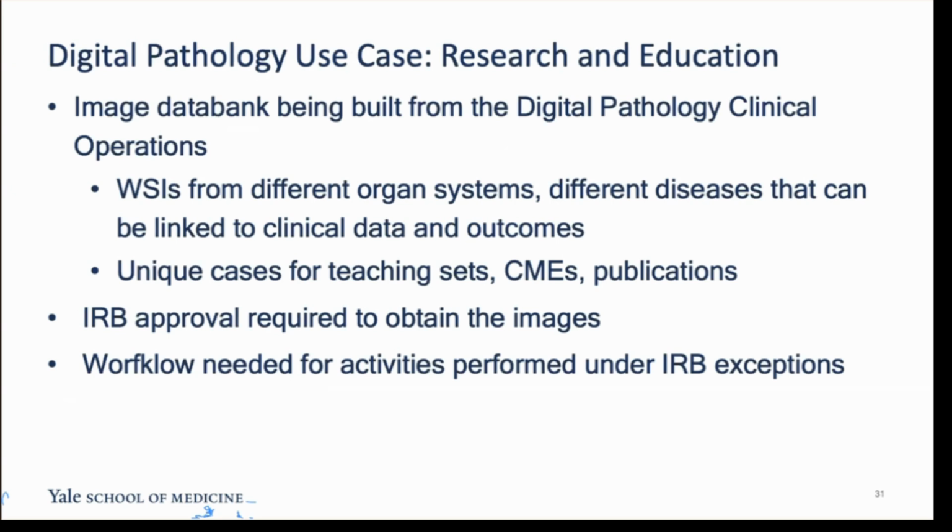Now, as with any academic medical center, we of course also have the research and education aspects of our work. And so as part of the clinical operations, the one thing we are doing now here is building up an image data bank. And this has whole slide images from different organ systems, deals with different diseases that can be linked to clinical data and outcomes. So there is stuff here that can be mined for research. In addition to that, there are unique cases that can be part of teaching sets, CMEs, publications, and so forth.